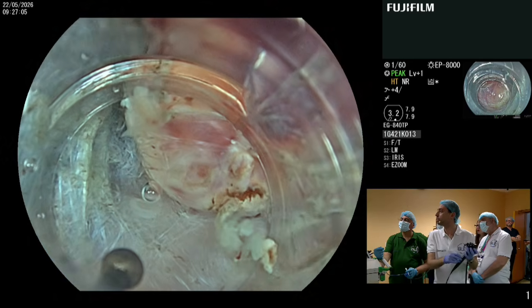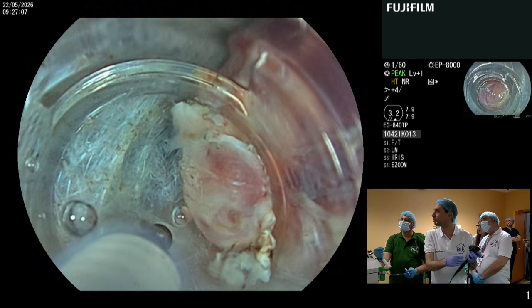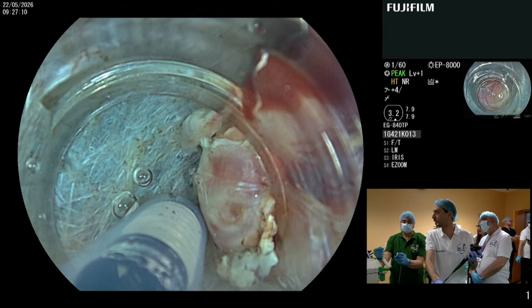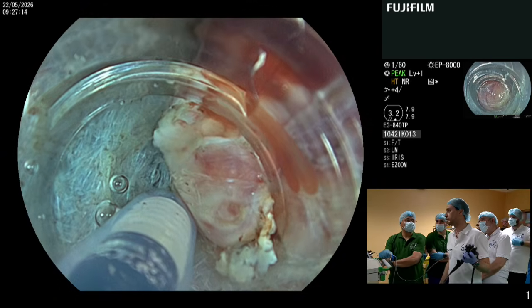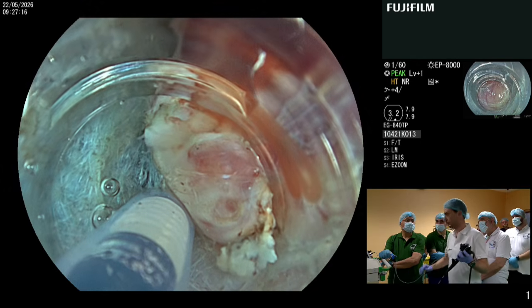Georgios, how long do you think it will last starting from this moment, approximately? It depends whether we will have any bleedings. Between 30 minutes and 1 hour, I think.